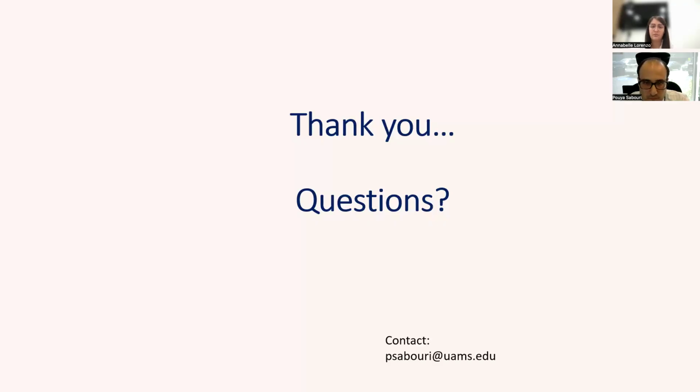Okay. I heard about some technical difficulties also with SGRT systems, like if the snout gets very close to the patient, then you can lose some signal. Do you have a comment on that?